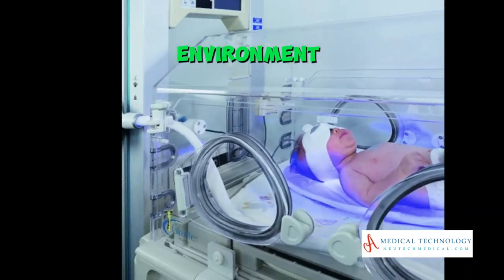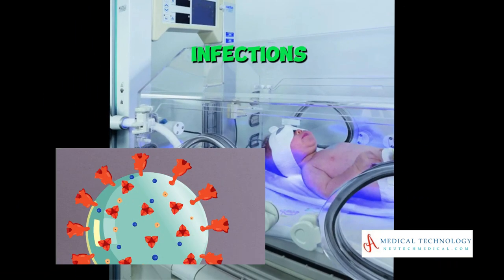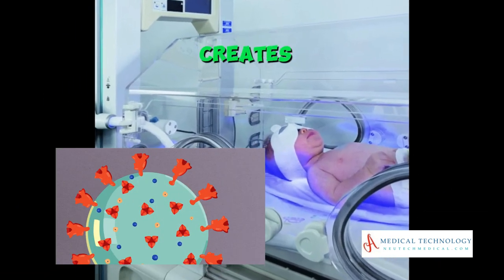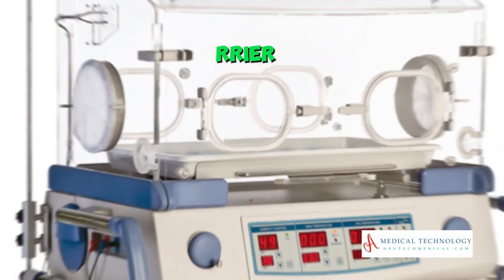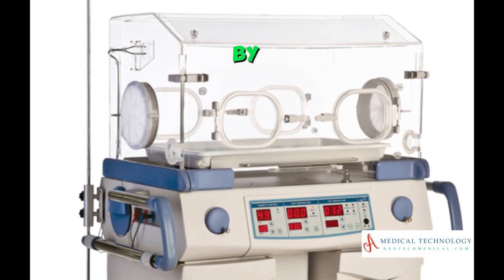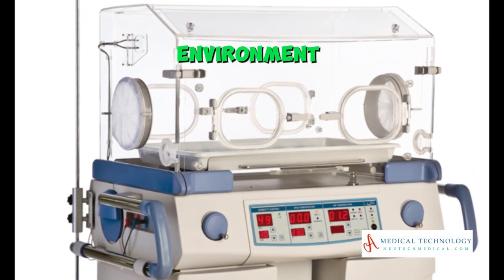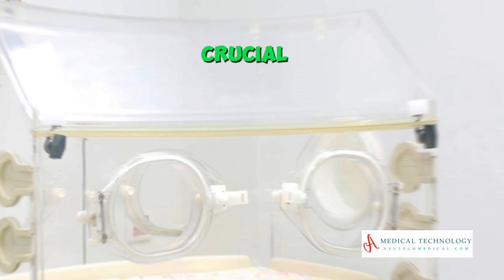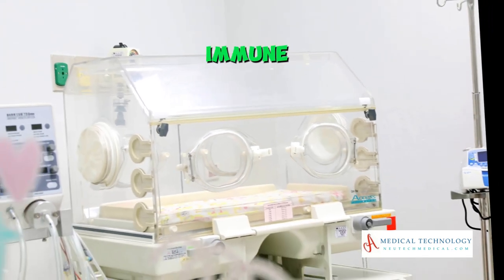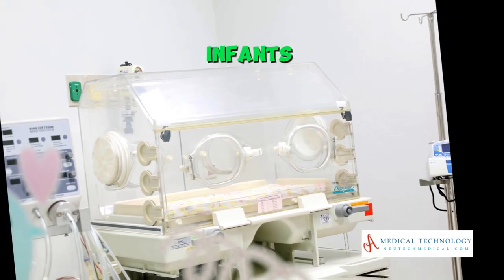Sterile environment — barrier against infections. The incubator creates a barrier against external infections by maintaining a sterile environment. This is crucial for the vulnerable immune systems of premature infants.